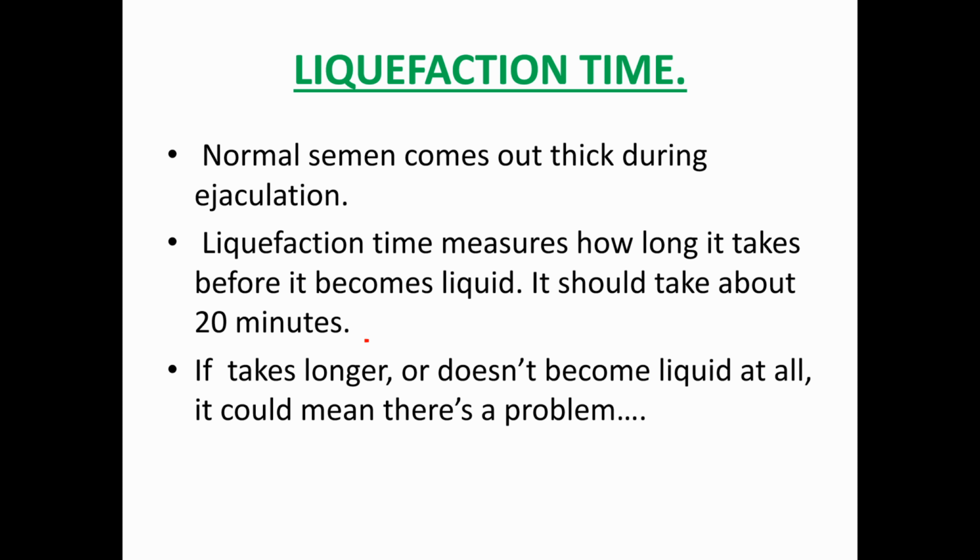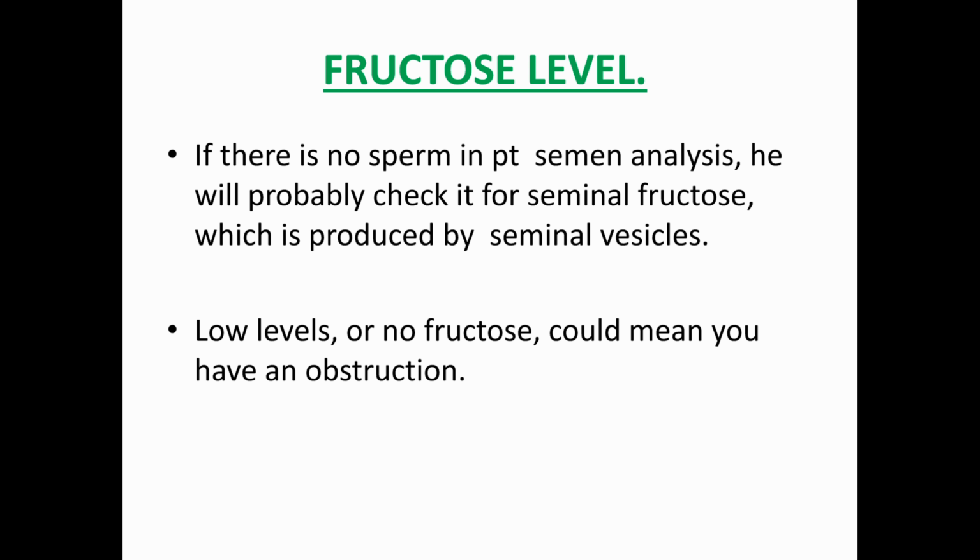As I told you, the ideal liquefaction time is 20 minutes, and the liquefying agent is the prostatic enzymes. If the semen is not liquefied after more than 20 minutes, it definitely indicates there is some abnormality with the prostate of that patient. Now come to the fructose level. As I told you earlier, fructose is an indicator of the seminal vesicle.